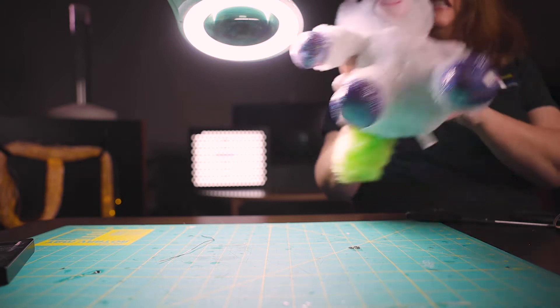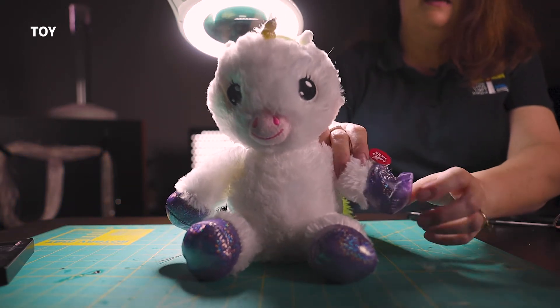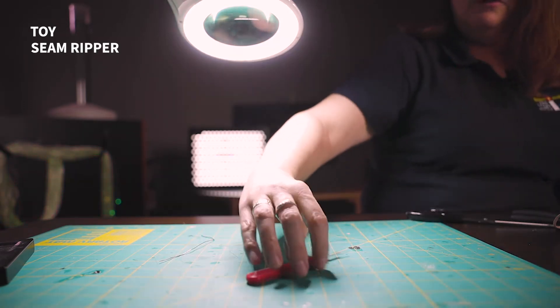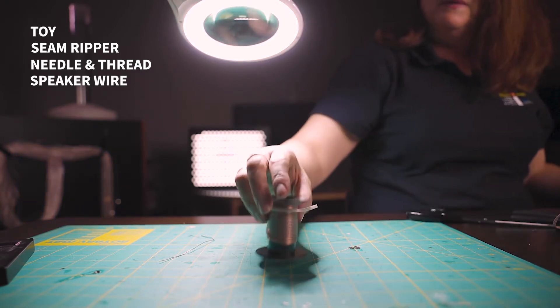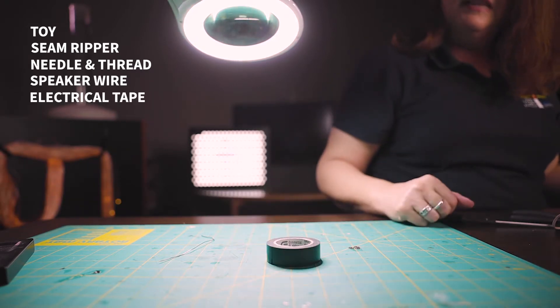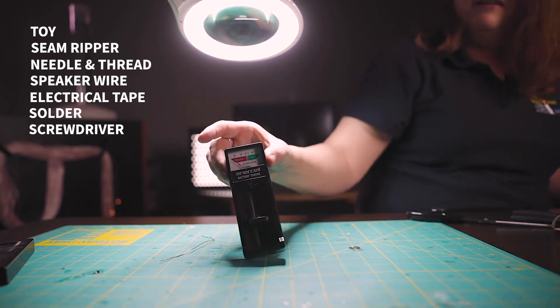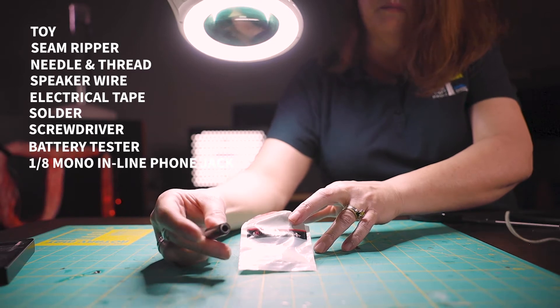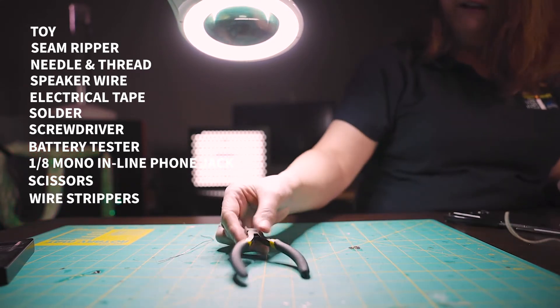First you're going to need a toy, and you'll want to pick one that has a switch in the hand or in the foot. You'll also need a seam ripper, a needle and thread, speaker wire, electrical tape, solder, a screwdriver, a battery tester, a 1/8 inch mono inline phone jack, scissors, and a wire stripper.